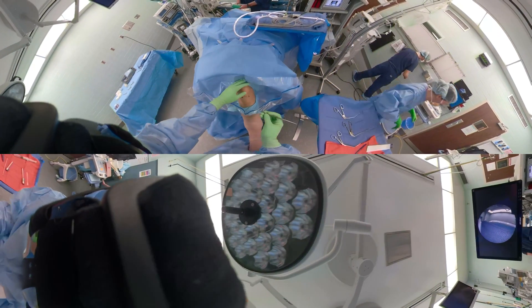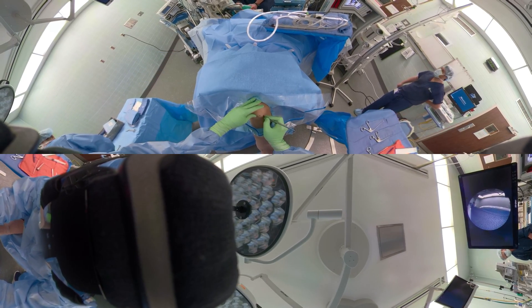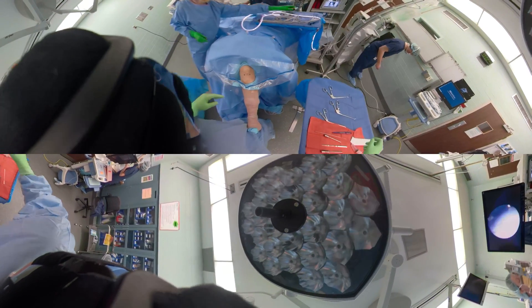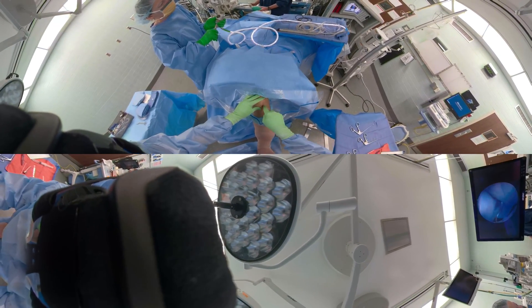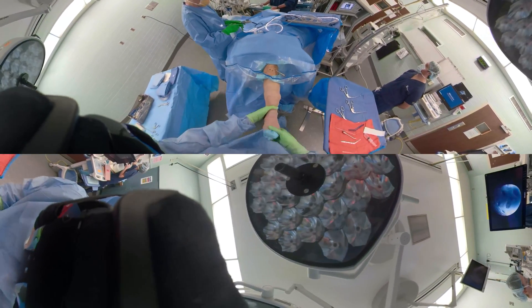Here is our portal incision — this is a left knee, lateral portal. Again, go deep and make a big enough mini arthrotomy so that we can get the cannula in and move around easily. This is a big cannula with a blunt obturator, with the knee in about 30 degrees of flexion. Then going out to extension, go ahead and put the cannula into the suprapatellar pouch.